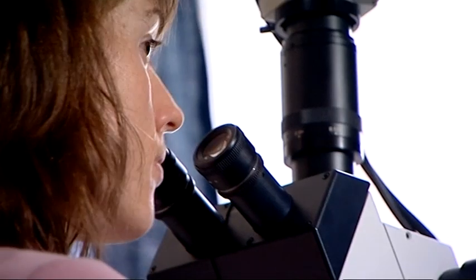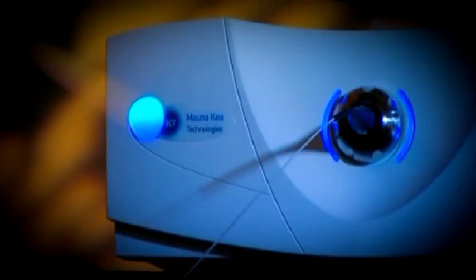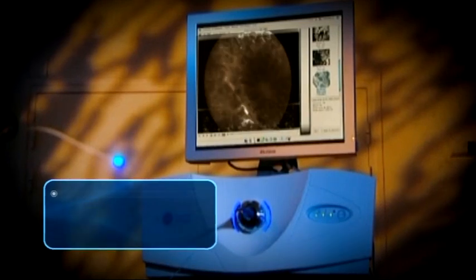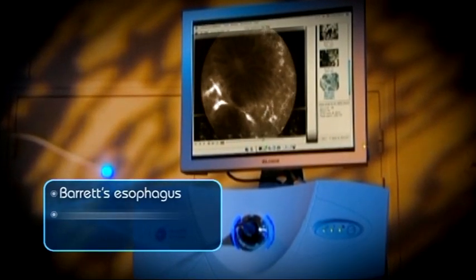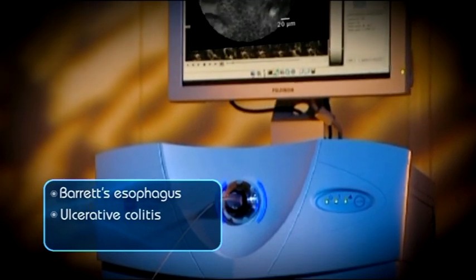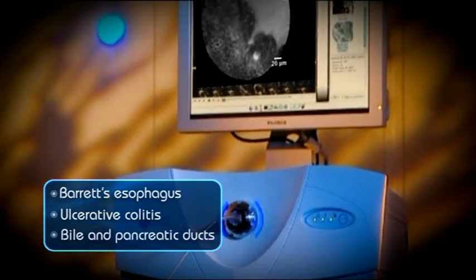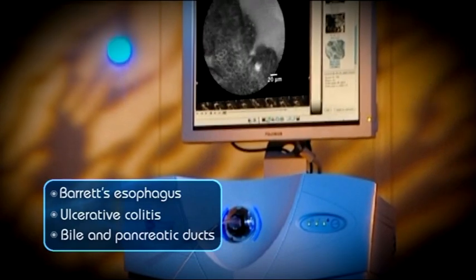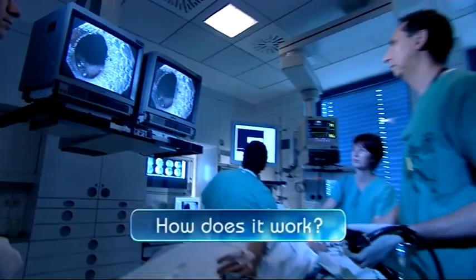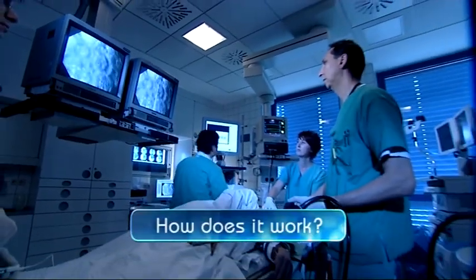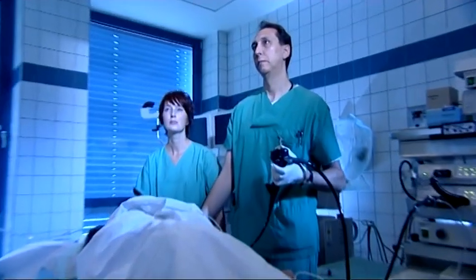Salvezio can enhance GI endoscopy procedures like surveillance of Barrett's esophagus or ulcerative colitis, and the diagnosis of pre-cancerous conditions of the bile and pancreatic ducts.